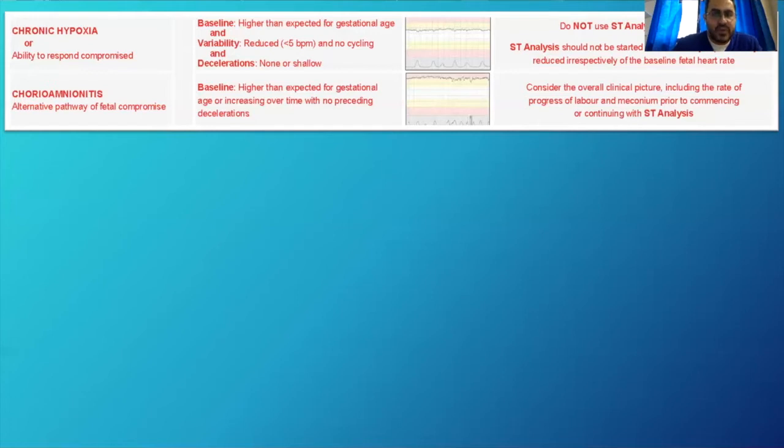It's also very, very clear that we need to make sure that we tell mom that we don't know what the status of the baby is at this point. This baby is not telling us enough whether it's well or not. What we can see is that this baby is not engaging, this baby is not responding. Some of the babies will be born in good condition, although we still can say it can't tolerate labor, but it hasn't been stressed out enough.